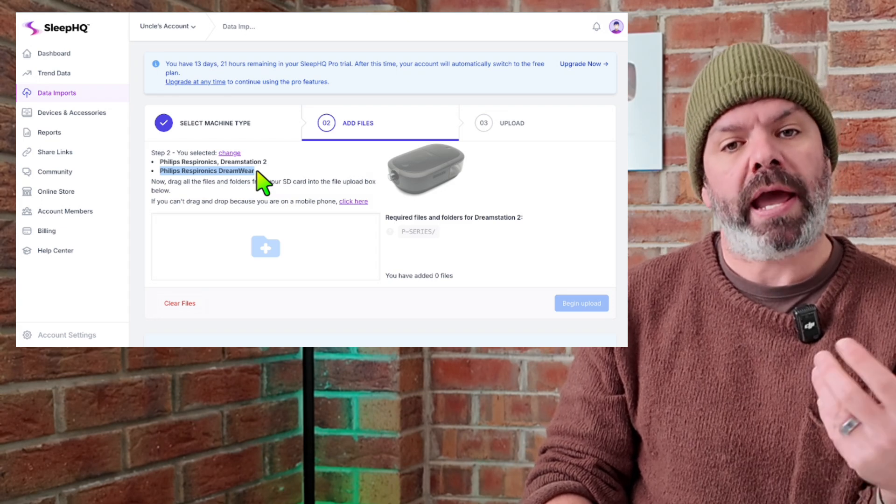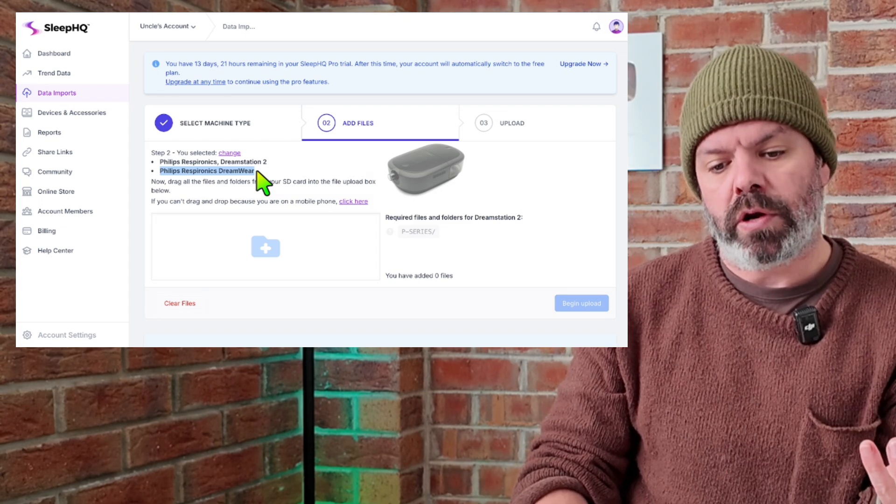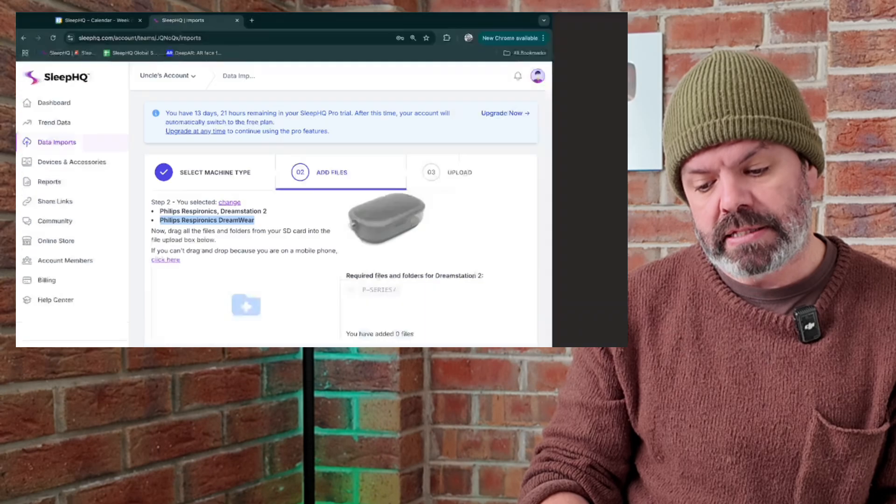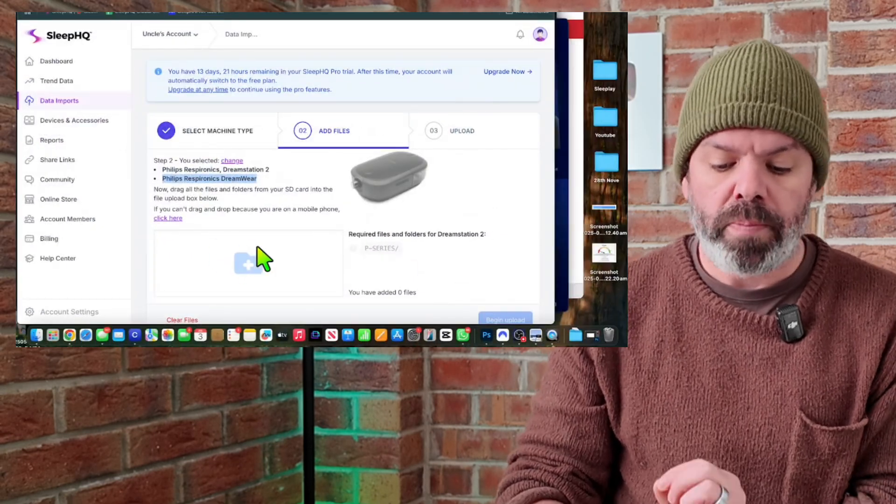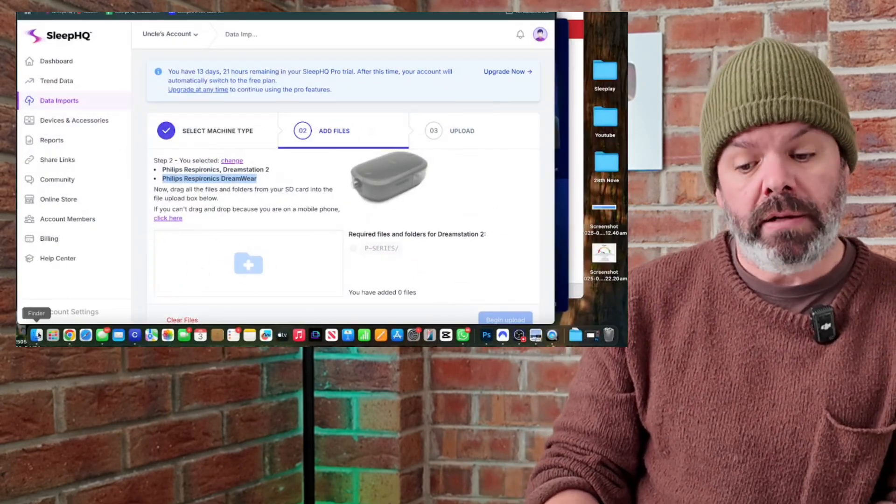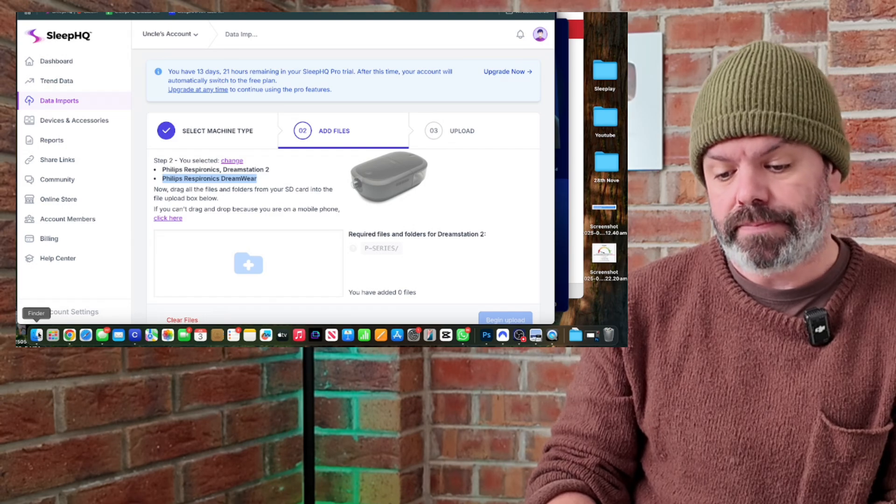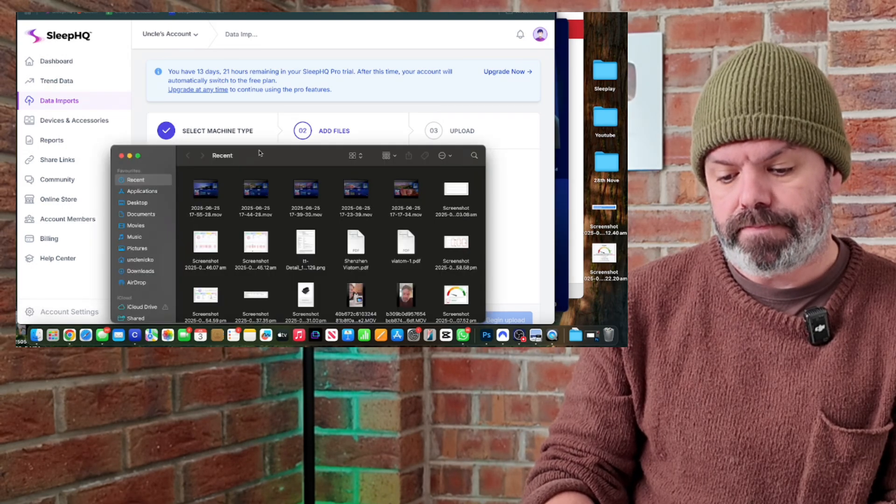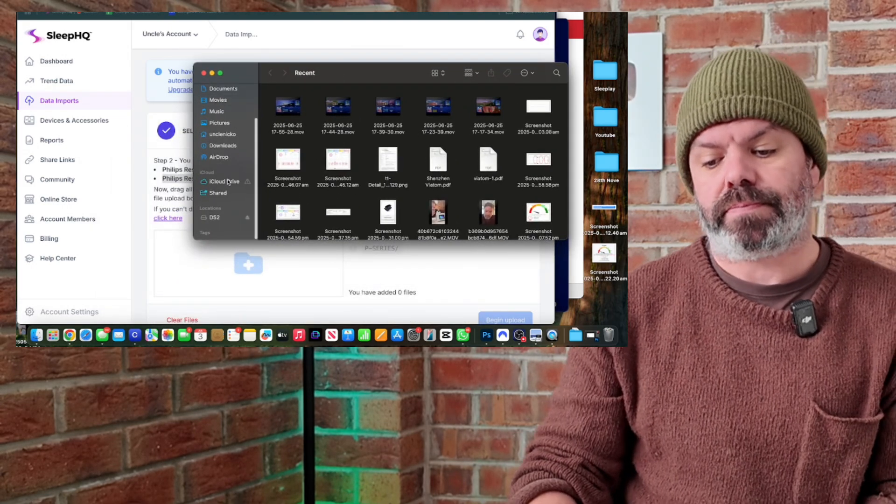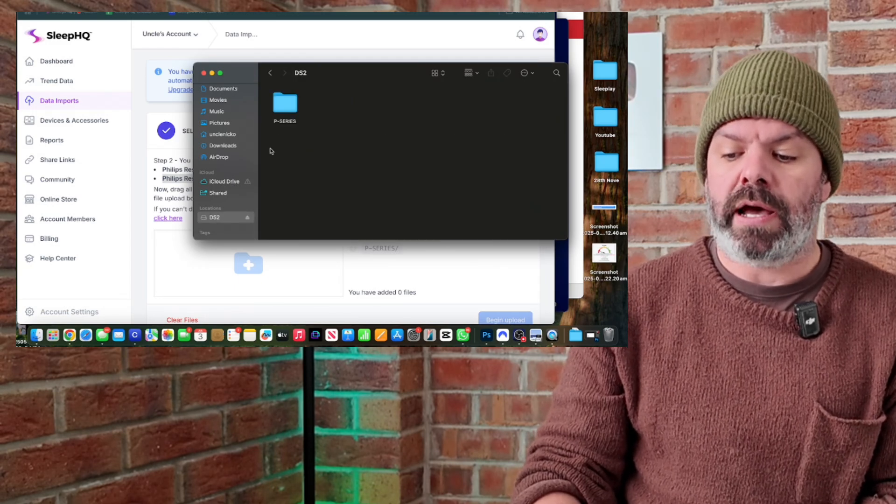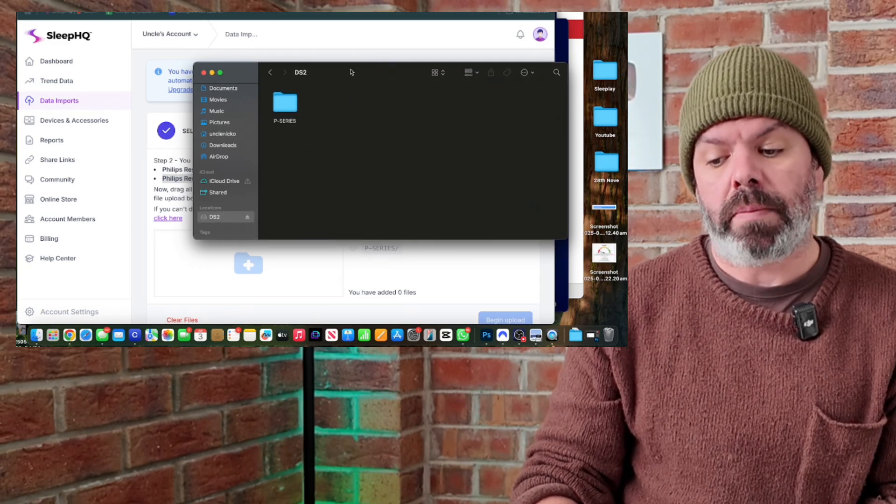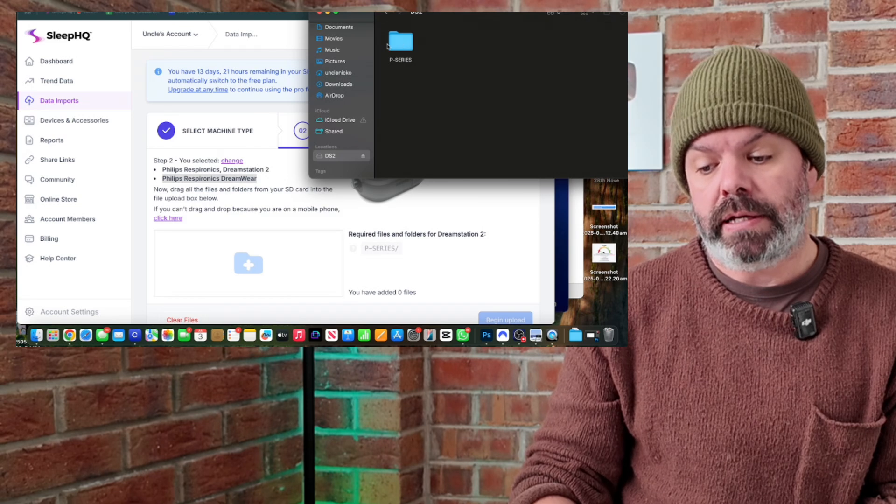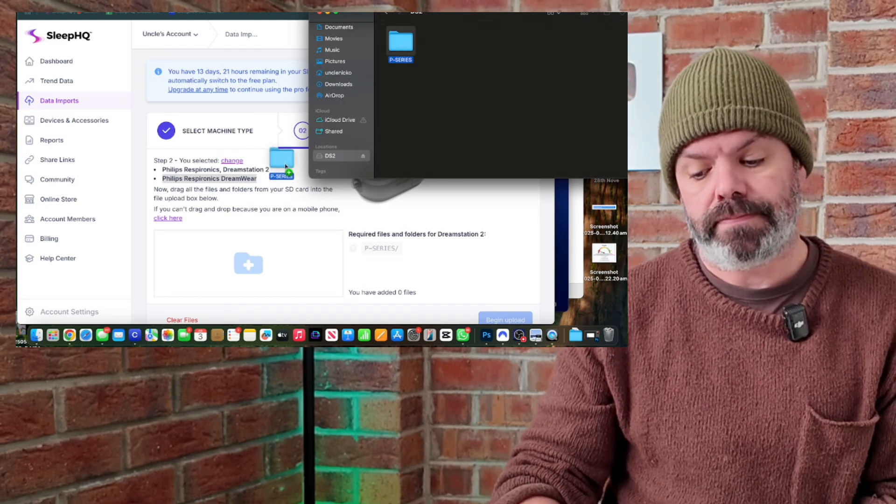So we're going to locate our SD card and then we're going to drag and drop the files into this section here. So on my Mac here, I'm going to go to Finder to find the SD card. Here it is here.